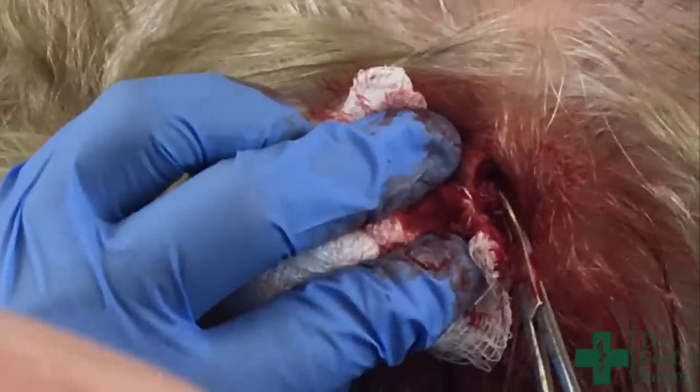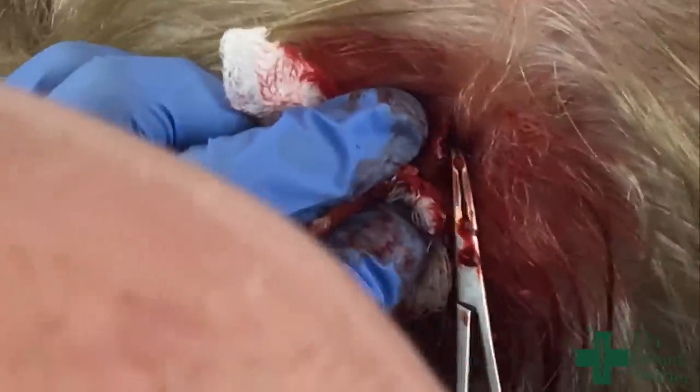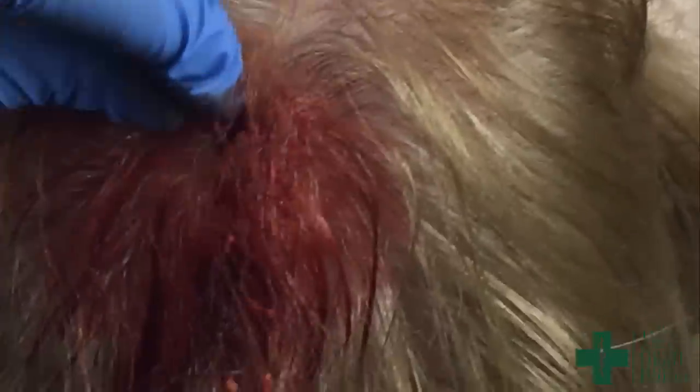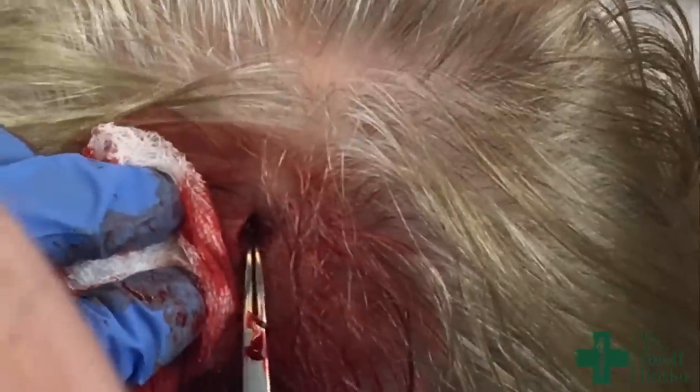So Matthew, I'm going to drop a syringe of normal saline or some sterile water and we'll just irrigate. When residents are doing this, it'll feel like it's just bleeding, bleeding, bleeding. This isn't a lot, and it gets in the way of your field, but this will settle nicely once we put the sutures in. If we were really worried about it, we could clamp it and suture it, but I'm not overly worried about that at this stage.